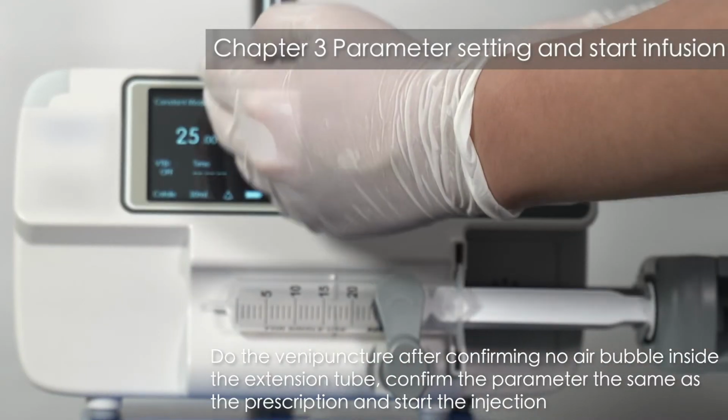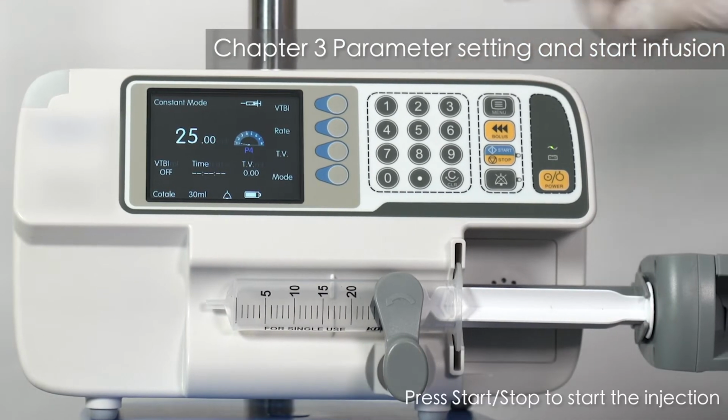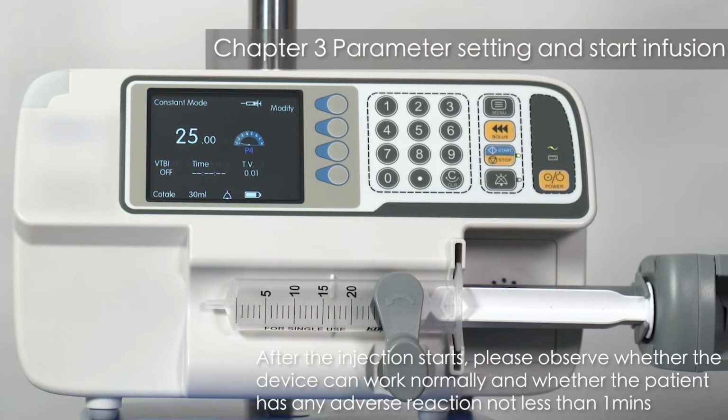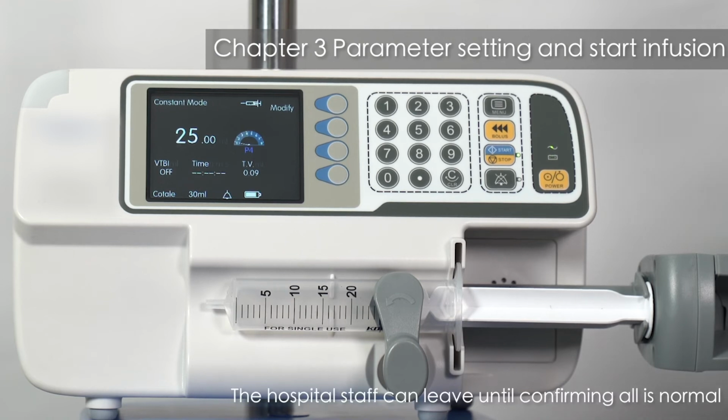Confirm the parameter the same as the prescription and start the injection. Press Start, Stop to start the injection. After the injection starts, please observe whether the device can work normally and whether the patient has any adverse reaction not less than 1 minute. The hospital staff can leave until confirming all is normal.